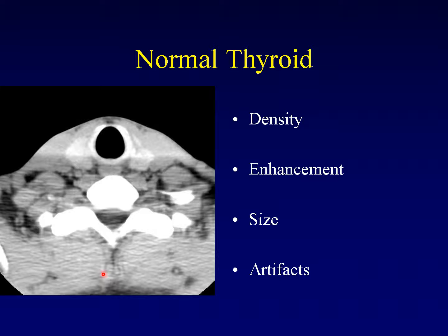The region of the thyroid gland is prone to artifacts. This beam hardening artifact running across the center of the thyroid gland is common. It comes from beam hardening from the shoulders. Sometimes we will try to draw the shoulders down to get them out of the way if we are imaging for thyroid pathology, but often this is impossible in larger individuals.